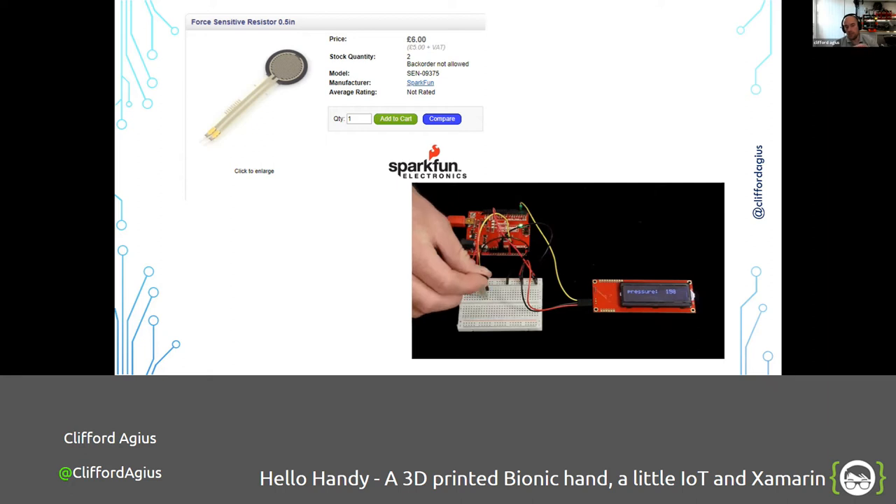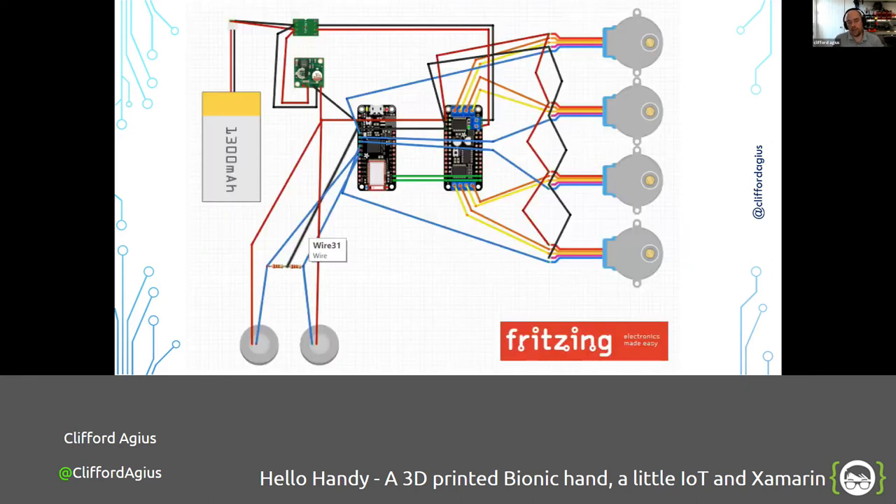I changed the software so when he hit the sensor it moved the hand to that position. But Caden gave me good feedback — he said he didn't like it because he preferred the MyoWare sensors where he could apply pressure, stop the hand mid-action, and have more control. So we went back to the drawing board. I then found force-sensitive resistors on SparkFun — as you apply pressure, the resistance changes and you can measure a varying voltage on the analog input. A bit more expensive at £6 for a pack of two.